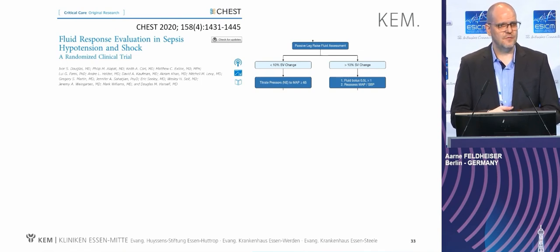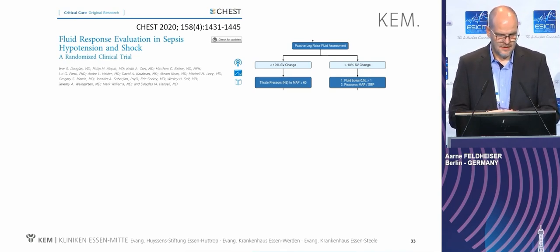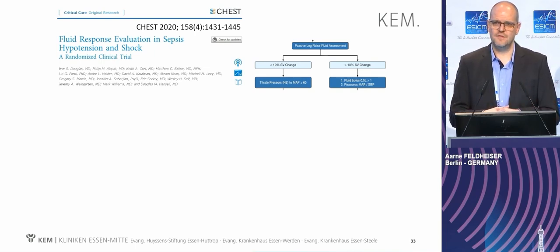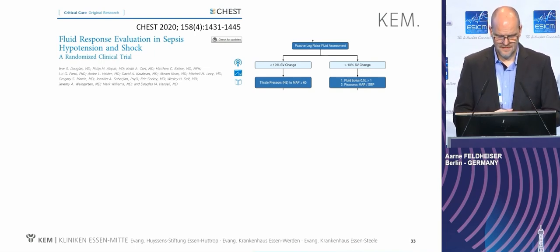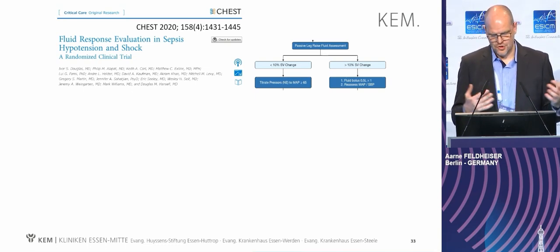Published is such an algorithm, the Starling algorithm, by Professor Douglas, in Chest, in septic patients. They did a passive leg raising test in early septic patients, and according to the stroke volume change measured in this monitoring device, they did the vasopressor intervention or they did the fluid intervention.